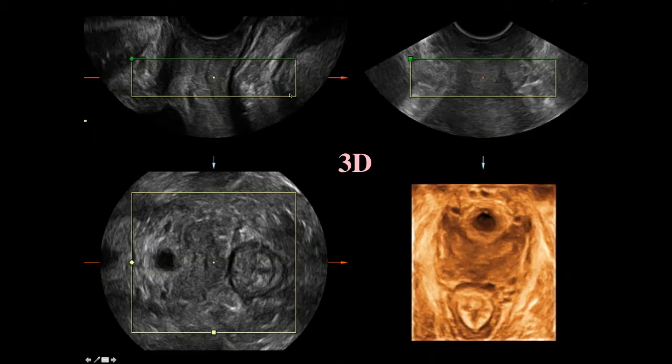And if you put your box that you're going to do your 3D with right in the middle here, and you press your button, automatically you will get this basically C-plane or Z-plane, which is the floor of the pelvis. And here all I've done is a sort of thick slice technique and turned it right side up. And now you can see basically what we saw before on the diagram. You can see the urethra, the vagina. The vagina has a sort of smiley face because it's held up on each side by the levator ani. And then you have the rectum. You can actually even see the mucosa of the rectum and the internal-external sphincters.